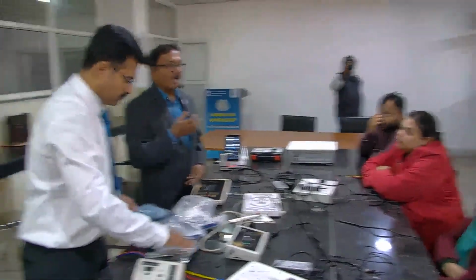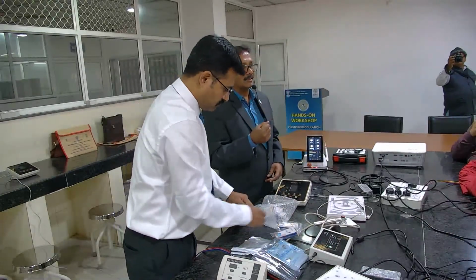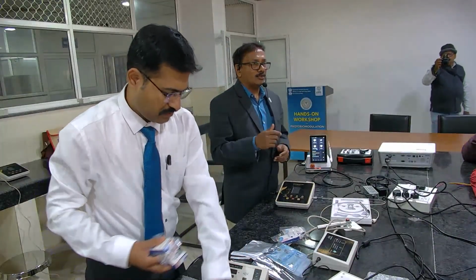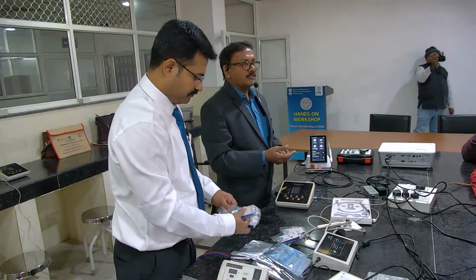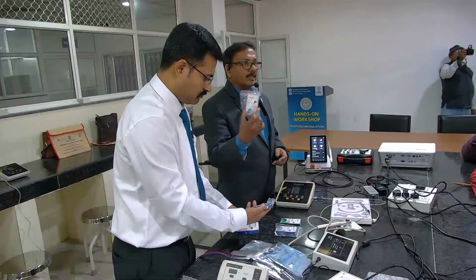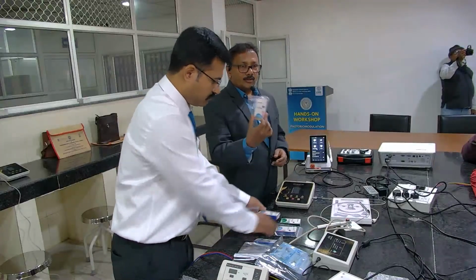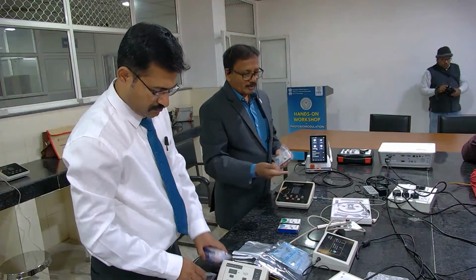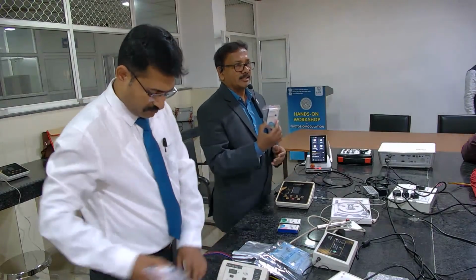So this has got the high affinity for absorbing the dyes. So once you wait for 4 minutes, all you have to do is take the laser of specific wavelength. If you're using methylene blue, this is the methylene blue dye. You have to take this, put it in the sulcus, wait for 4 minutes, and then irradiate with 660 nanometers.